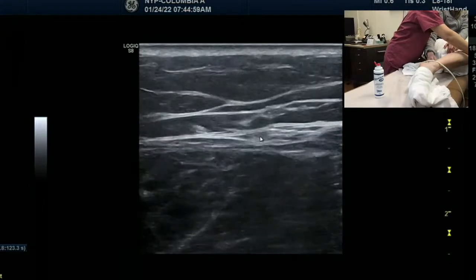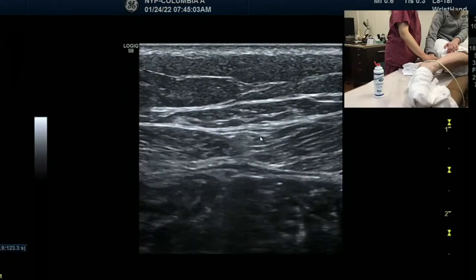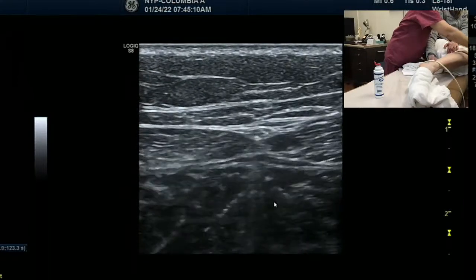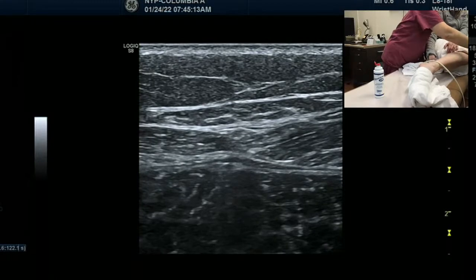As you scan, you know the direction, right? Because over there, now you found your place. It's this one, between the two heads. Soleus, this is a very good place to stay. I'm going to say the reason why I want to say this one. I'll comment.